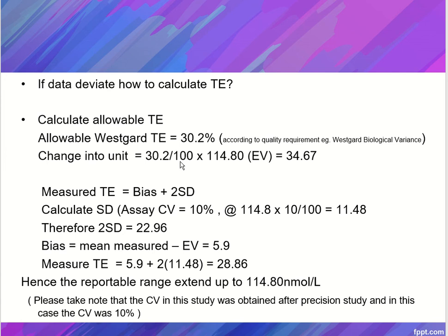In this case, I suspect the highest, which is 114.80. So you get the allowable total error of about 34.67.